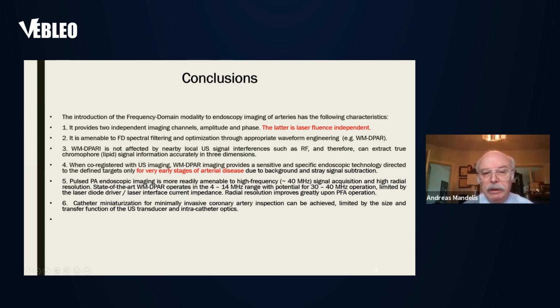But what we've shown here is, because of the optical response of the system, even in the frequency range from 4 to 14 megahertz, we're able to see the size of the plaque, very small size of the plaque, because we're really looking at optical absorption as opposed to purely ultrasonic dispersion, which is long wavelengths, smearing of the feature, and not being able to look at a good spatial resolution. So the light allows us to increase the spatial resolution compared to the ultrasound.